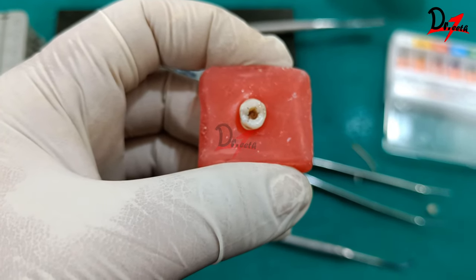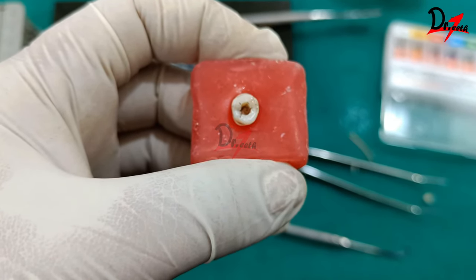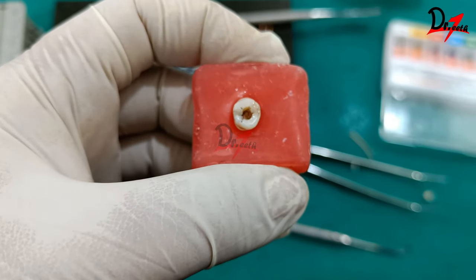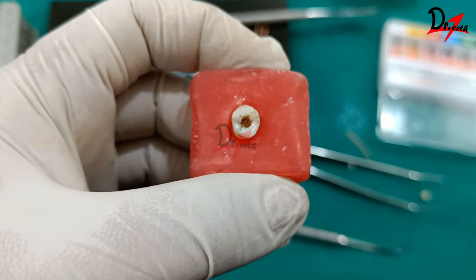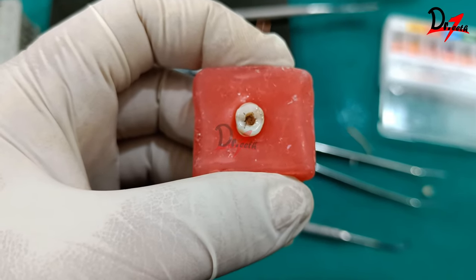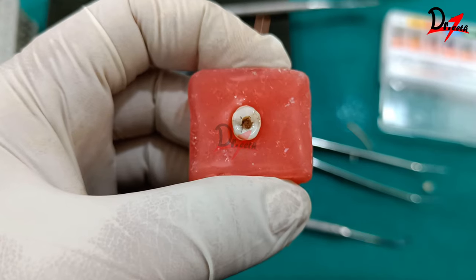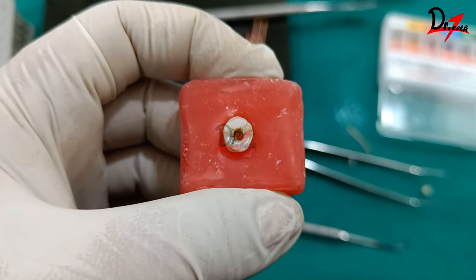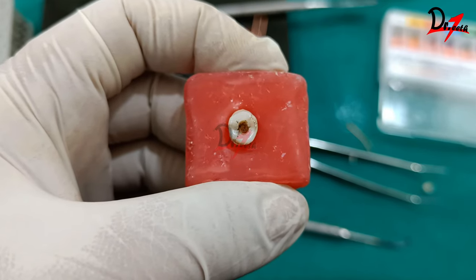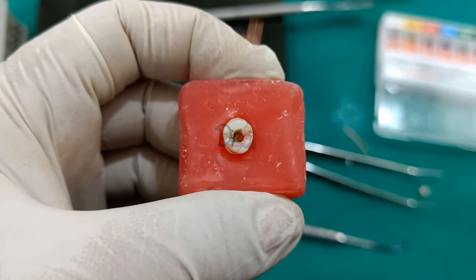After obturation, post-endodontic restoration should be placed as soon as possible — whether composite restoration followed by a crown, composite alone, or post and core. This prevents percolation of fluids from the oral cavity into the root canal, thereby improving the prognosis and success of the treatment.